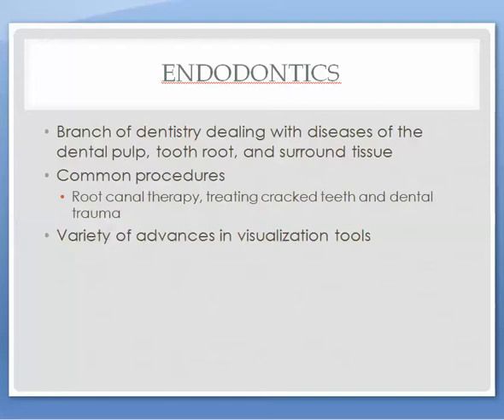Endodontics is a specialization in dentistry focused on dental pulp, the tooth root, and the surrounding tissue. They commonly treat cracked and decaying teeth and dental trauma, but primarily deal with root canal therapy, abbreviated RCT. This area has been riddled with musculoskeletal disorders and has greatly benefited from advances over the past 15 years. New technologies and optical aids have caused improvements in ergonomic concerns and surgical precision.